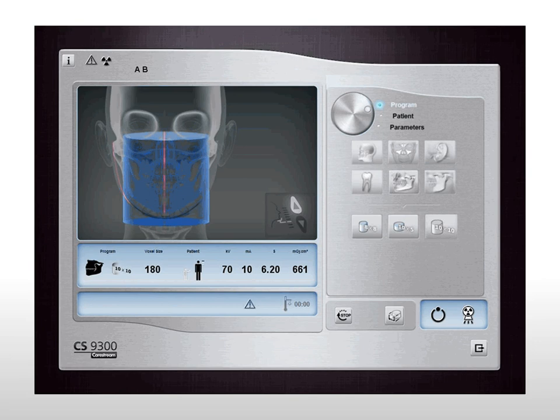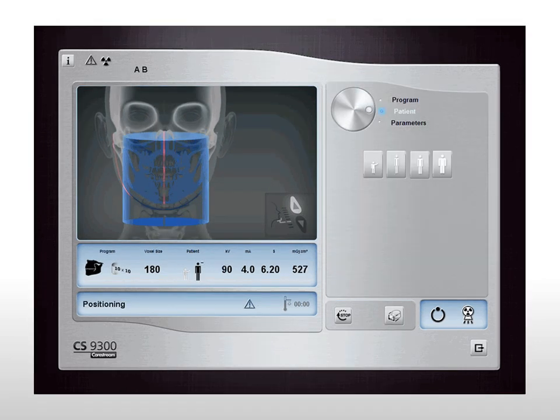Now it's your turn. In the 3D acquisition window, select the jaw program pane. Select settings for 10x10 dual jaw full acquisition. Select settings for patient size medium.